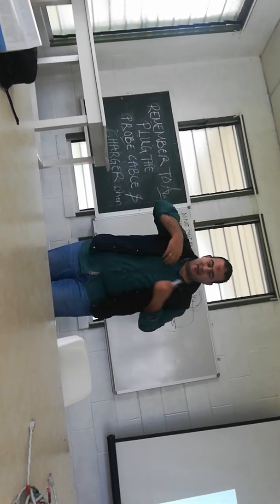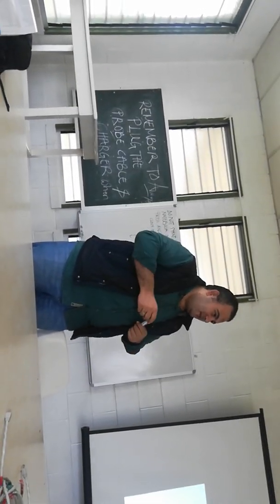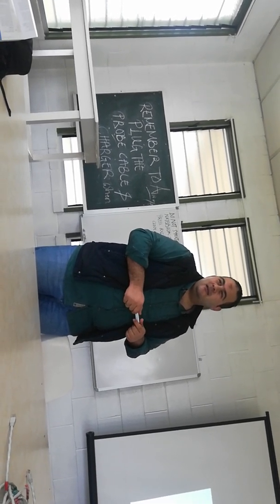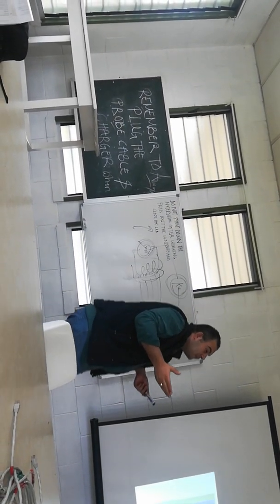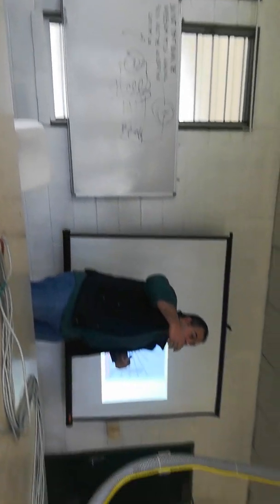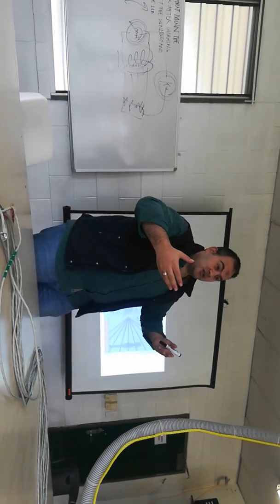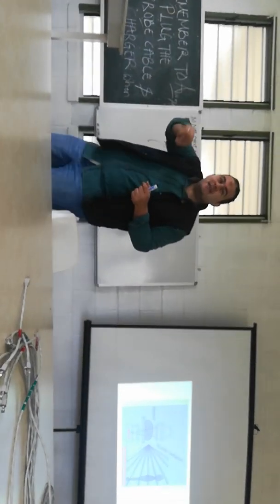For an X-ray image of the chest, for example, you will find that bone appears white and lung appears black. Why? Because there is no resistance in the lungs, so the photons penetrate fast. Photons incident on the patient are absorbed in high-density material, so bone will absorb a lot of radiation. So the transmitted radiation incident on the film will be very low.